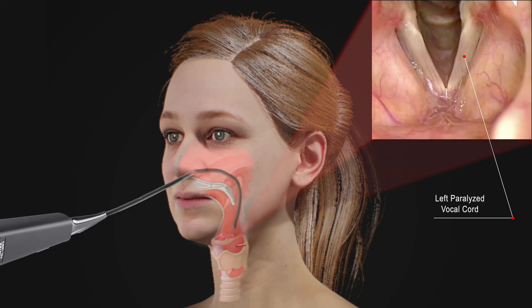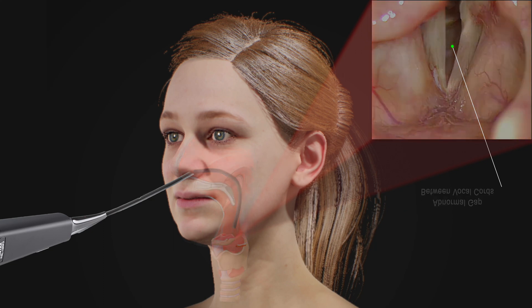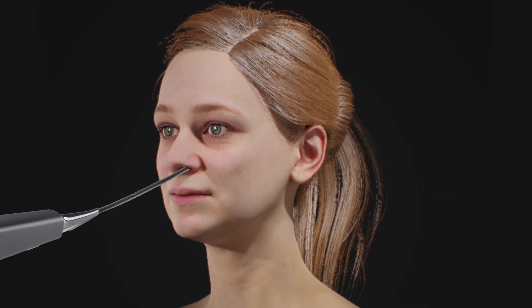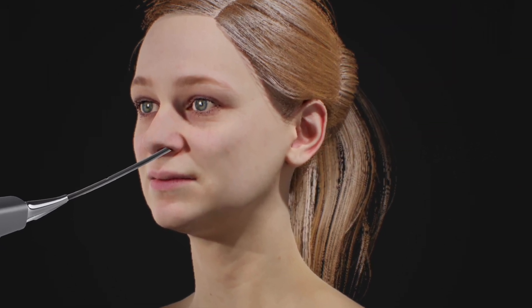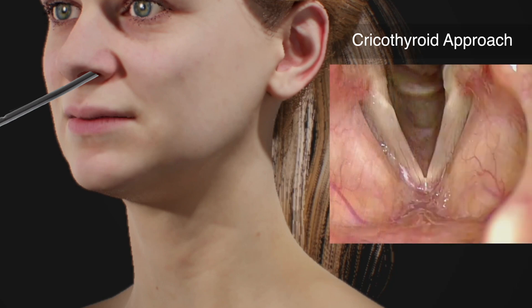At this point, the vocal cords are easily visualized, including the paralyzed left vocal cord. Note that the vocal cords do not come tightly together. The goal is to move the paralyzed vocal cord towards the middle so that the mobile vocal cord can meet it tightly. With tight vocal cord closure, the vocal quality and strength should improve significantly.